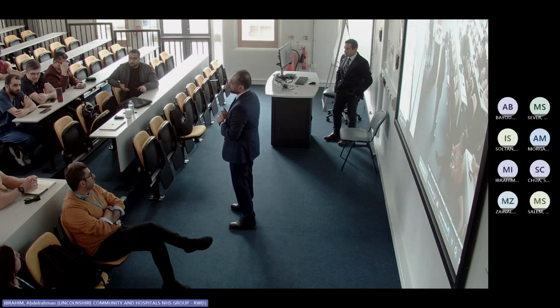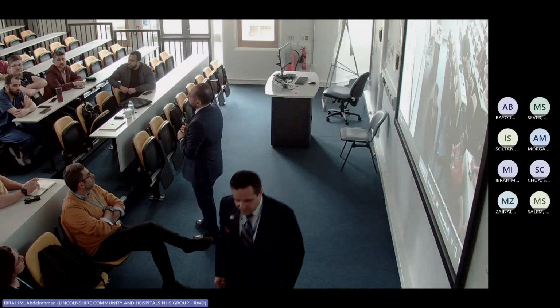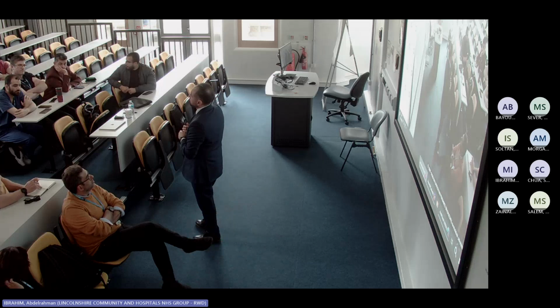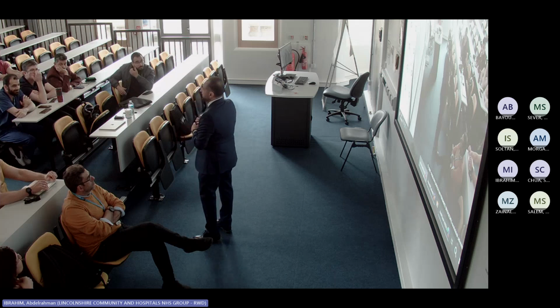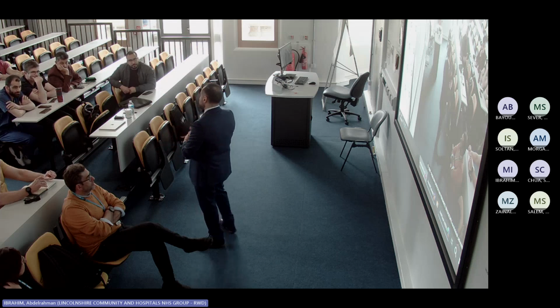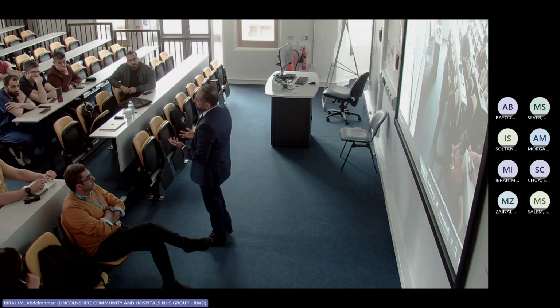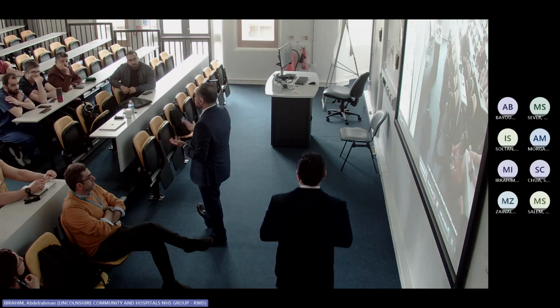Yeah, thank you. In considering exclusions, how much weight do you put on those who have persistent habits like heavy smokers who are not happy to stop smoking? Would you consider that an exclusion or not? Oh, well, that's very rough. It's something that we say that smoking is the cause of your nasal problem, and your nasal problem is the cause of your ETD. Still, if you did the turbinate surgery for this patient, for example, their symptoms will improve even if they are smoking and not smoking.